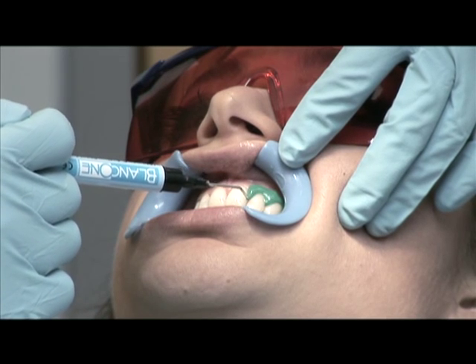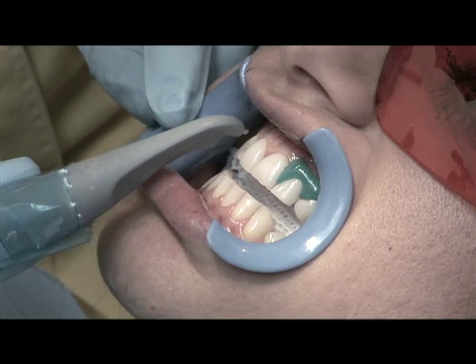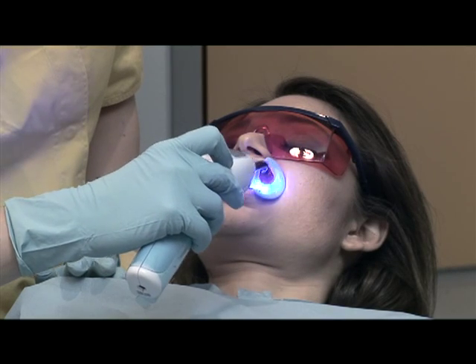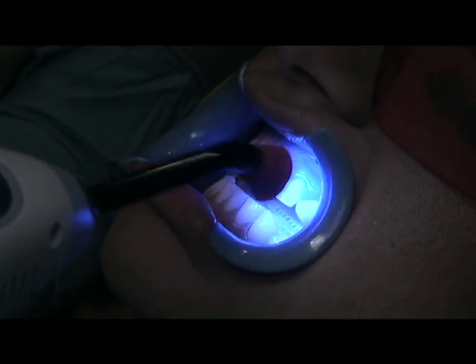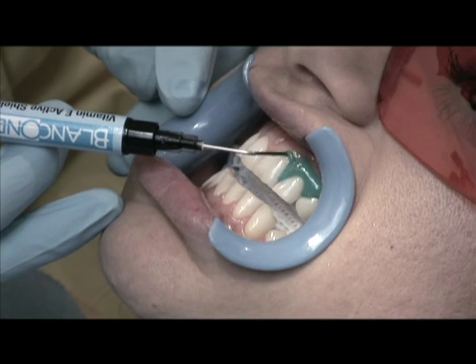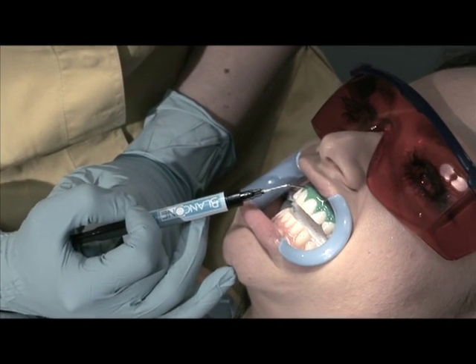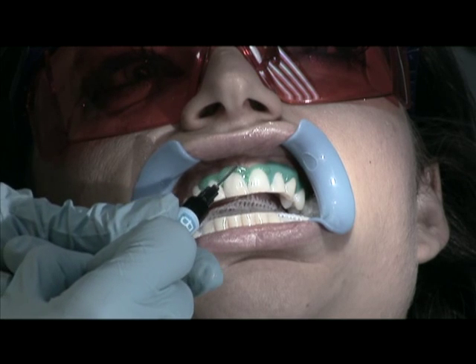Use the liquid dam to protect and isolate any recessed gum areas where the dentine is exposed. To polymerize the dam, move the lamp back and forth to avoid the unpleasant feeling of heat caused as the dam hardens. A special feature of this dam is that it contains vitamin E with emollient and anti-oxidizing properties that will prevent the gums from becoming dehydrated during the treatment, eliminating any risk of burns from peroxide.